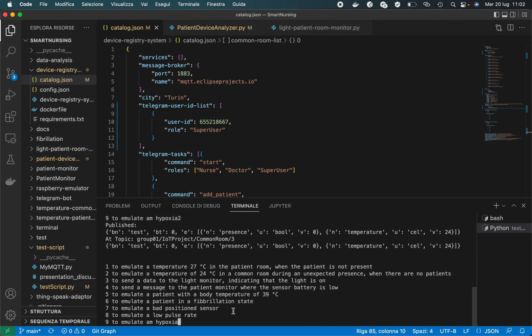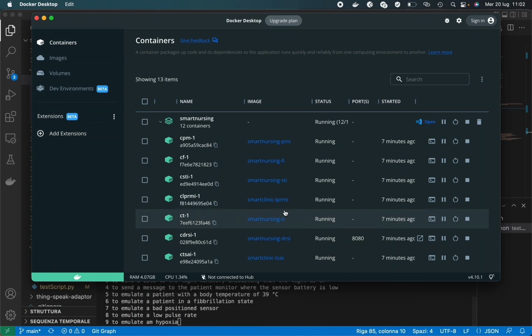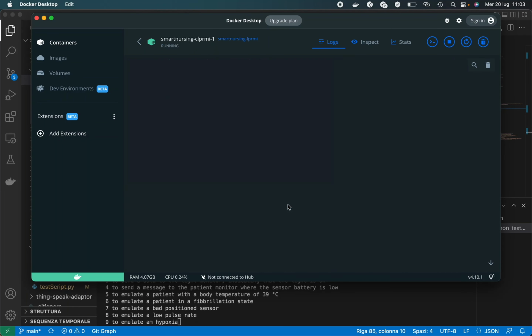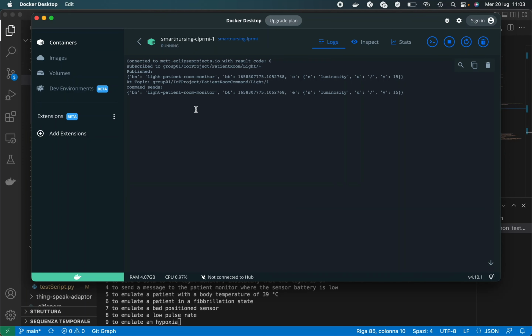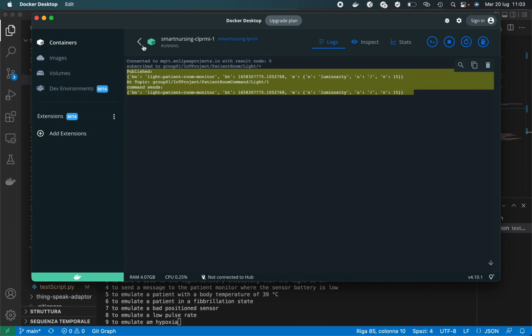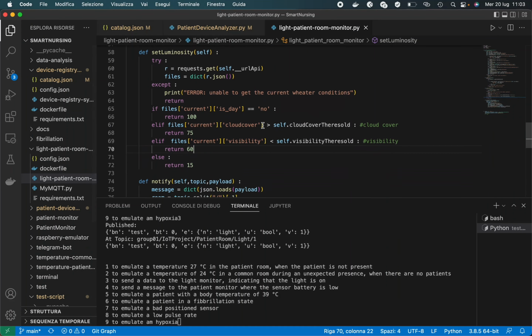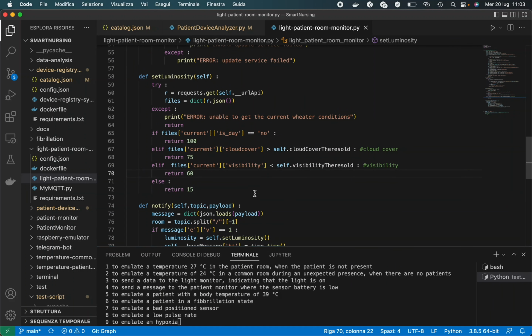Pressing 3, I will simulate a case where the patient has the light on. So let's see the actuation command sent by the light monitor microservice. This will notify the Raspberry to set the luminosity at 15 percent. This value is computed taking into consideration the current weather condition of the location of the nursing home, in our case Turin. The microservice receives that data, and since it's day and we have higher visibility without cloud cover, the luminosity is set at the lower value.